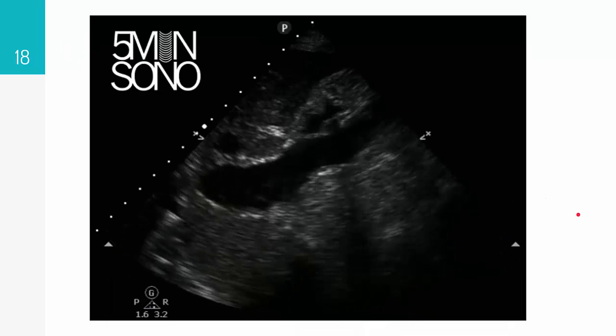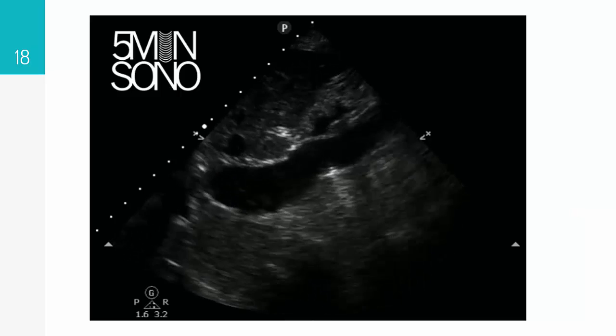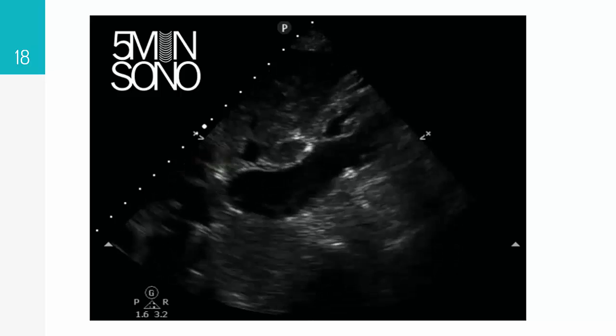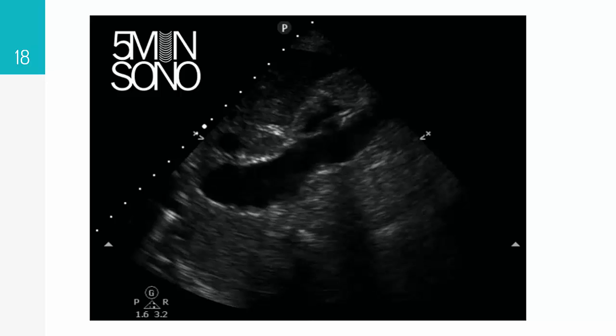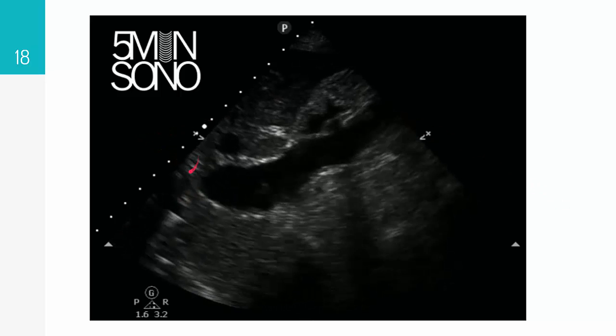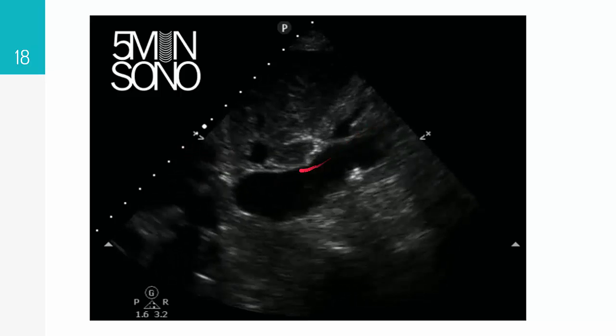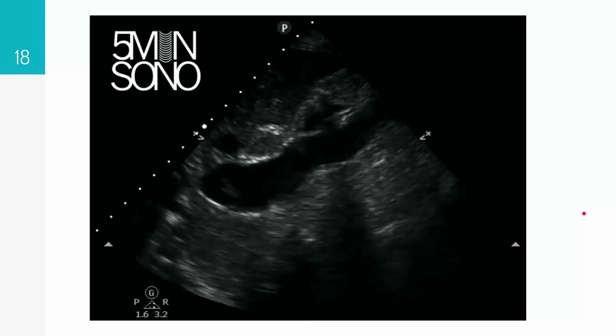So here's an excellent video from our friends at 5 Minute Sono demonstrating a nice plump IVC with minimal variation during respiration, suggesting that hypovolemia is not the source of this patient's hypotension. So again, up here you have right atrium, IVC, and we're seeing almost no collapse. So this is not a patient that needs to get a ton of fluid.